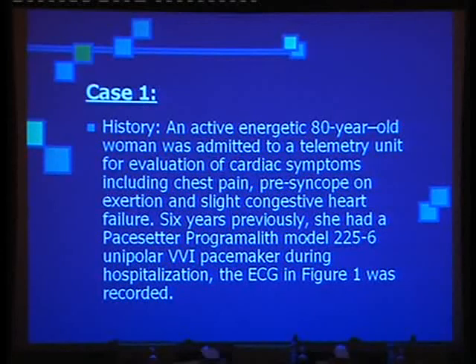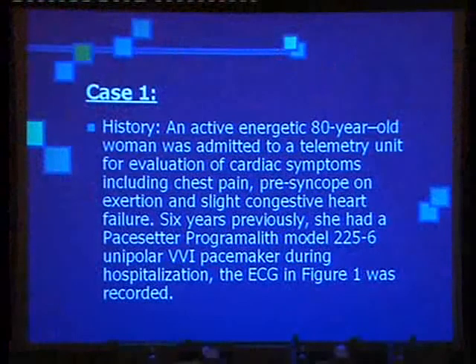So history is important. Here are the 3 issues of the history: chest pain, pre-syncope on exertion, and besides that, congestive heart failure. These 3 elements are very important to suggest that this patient may have pacemaker syndrome. Besides that, this patient has a unipolar VVI.